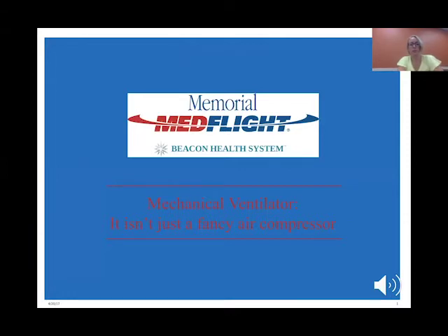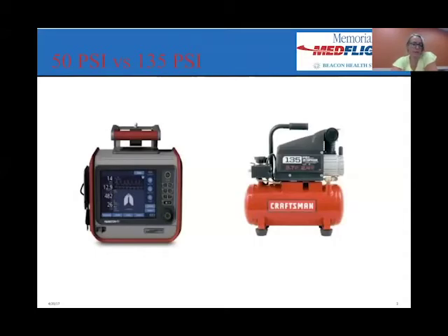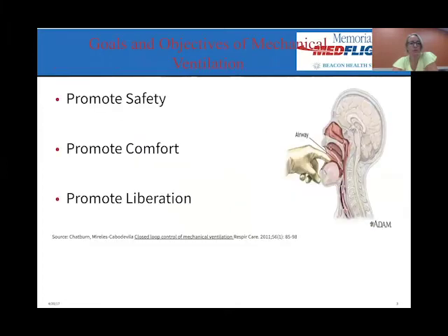So we're going to go over the ventilator and the basics of ventilation. And this is just showing that it's basically like an air compressor in a way. It's going to push air into the patient, but at a lot different pressures.